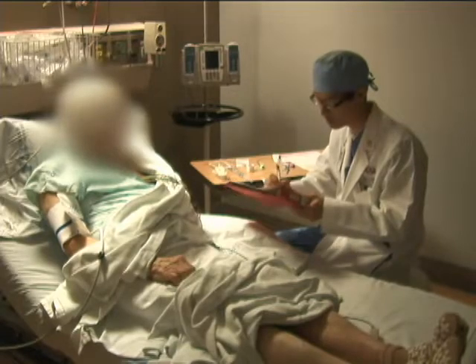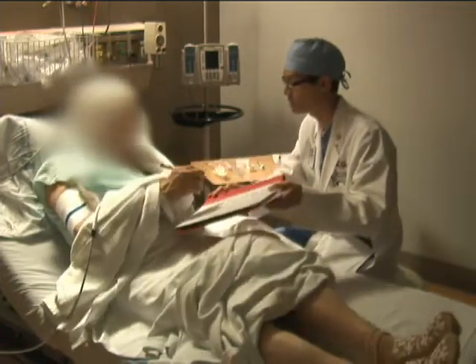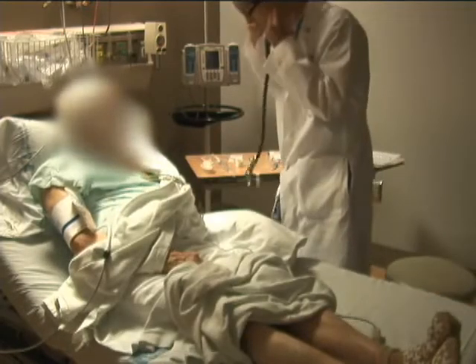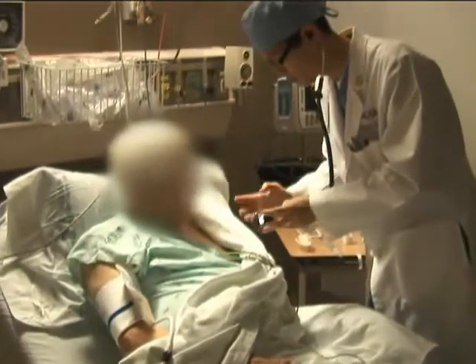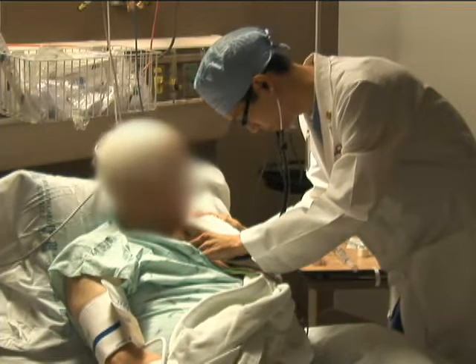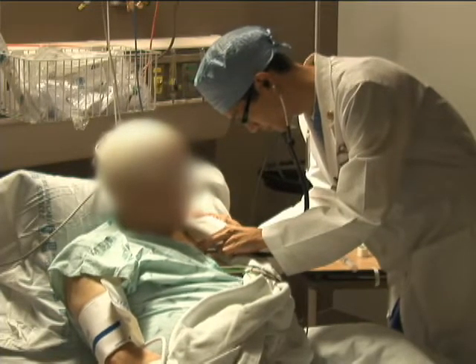The indications and potential risks and benefits of the procedure are discussed with the patient, and informed consent is obtained. A focused physical exam includes auscultation of the heart and lungs, visual assessment of the oropharynx, and palpation of the pulses is performed to assess the patient's risk for receiving moderate sedation.